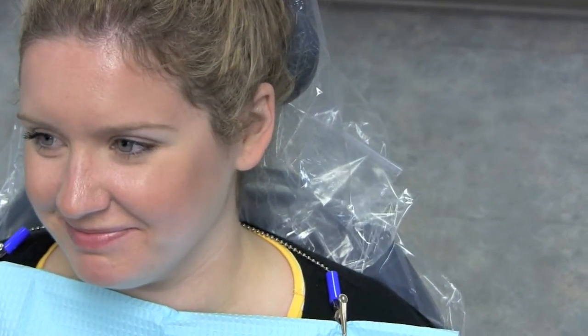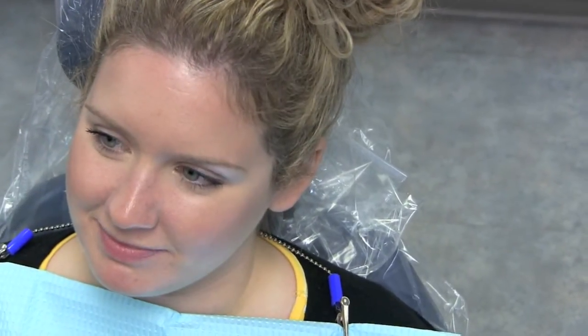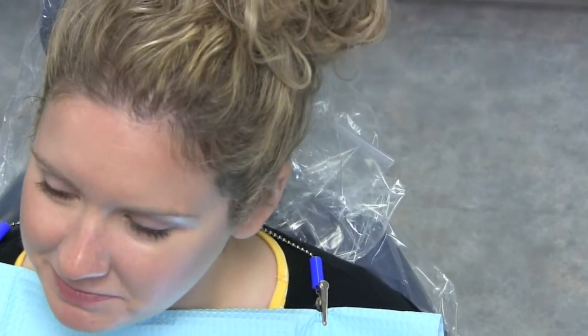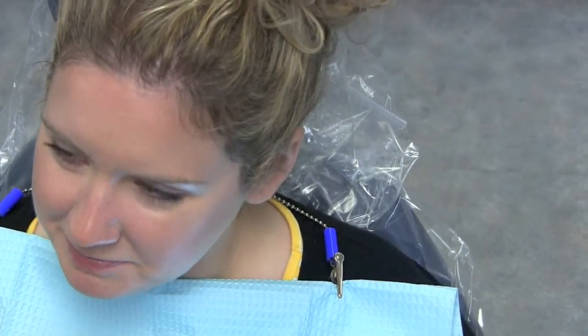Hi, Katie. Hi. My name is Ann, and I'm Dr. Smith's dental assistant, and I understand you want bleaching trays. I do. So I'm going to be taking impressions of your teeth today so that we can make those bleaching trays for you. I'm going to be taking impressions of your upper teeth and your lower teeth. Do you have any questions?